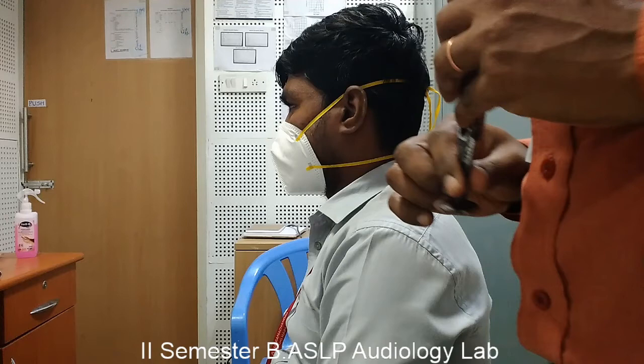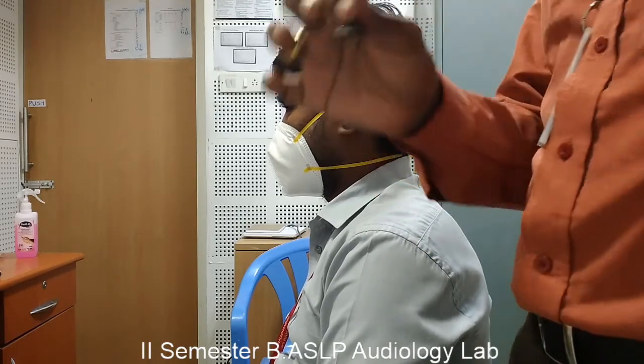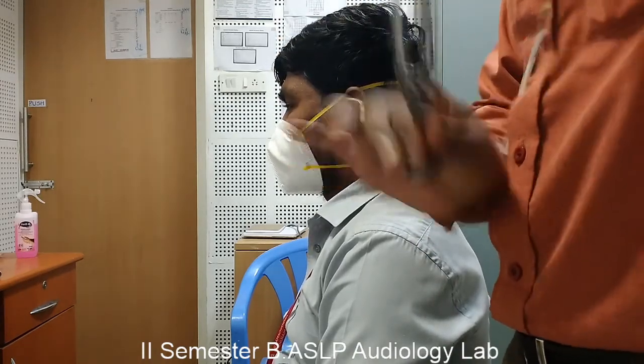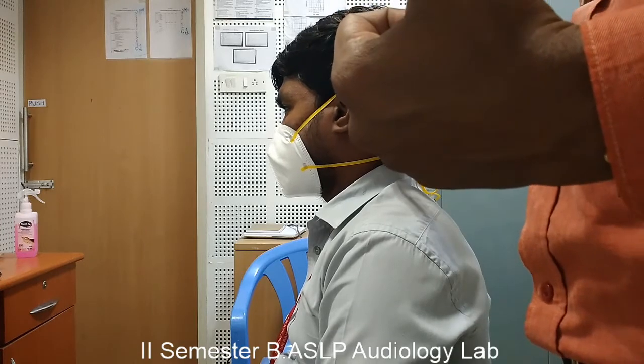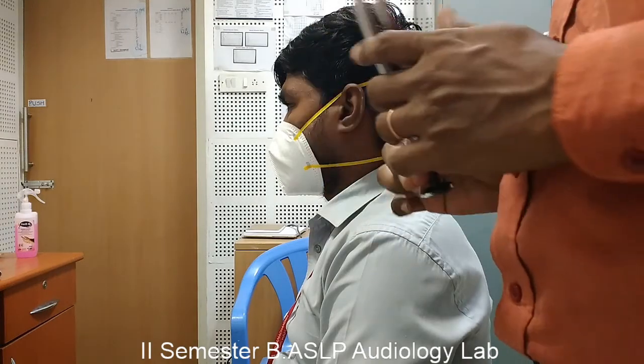The modified procedure for the Rinne test involves alternatively placing the vibrating tuning fork at the mastoid process and in front of the ear canal. This shortens the test procedure duration. The tuning fork will be struck and alternatively placed between the mastoid process and in front of the ear canal, and the subject has to tell where he or she heard the sound louder.